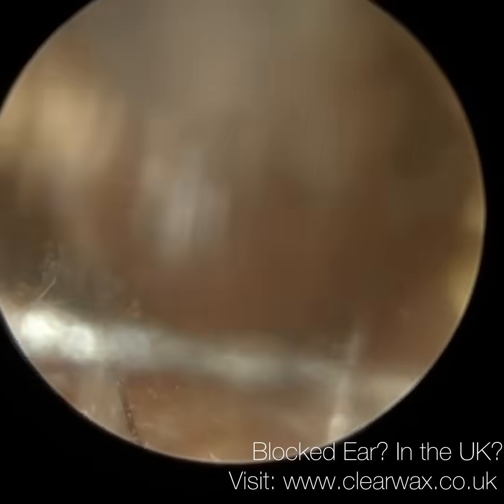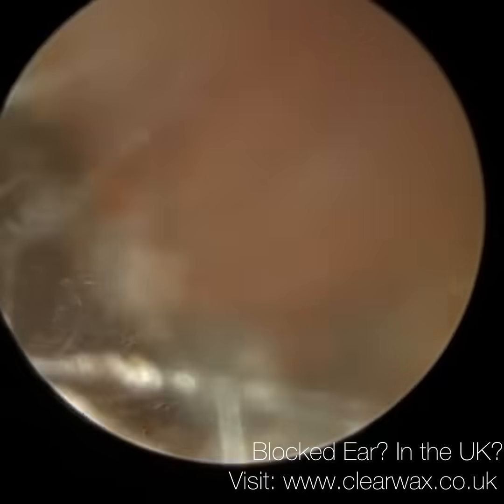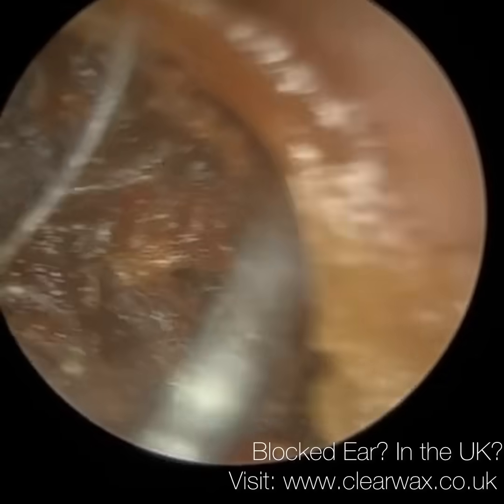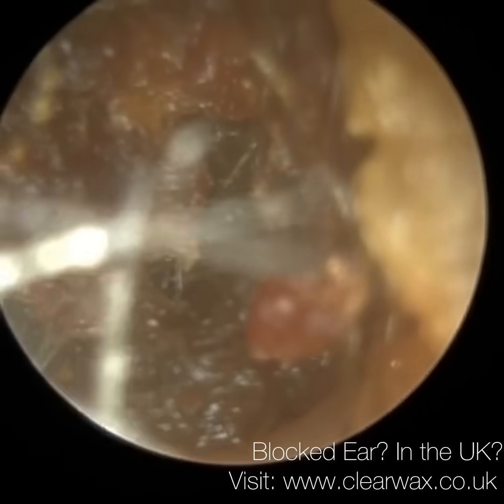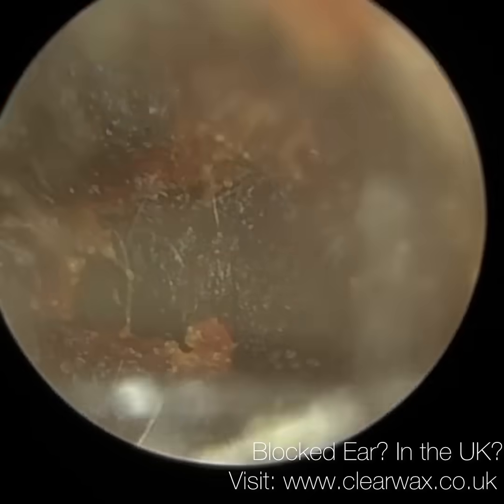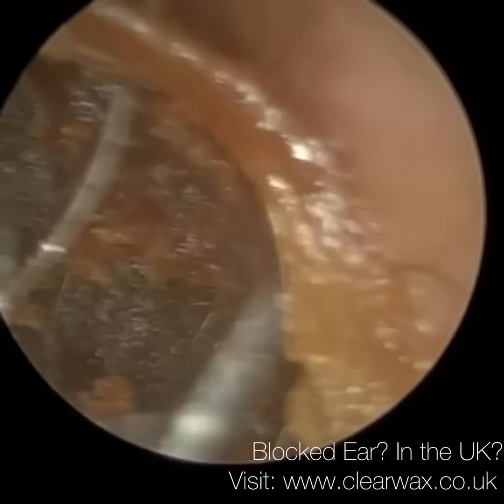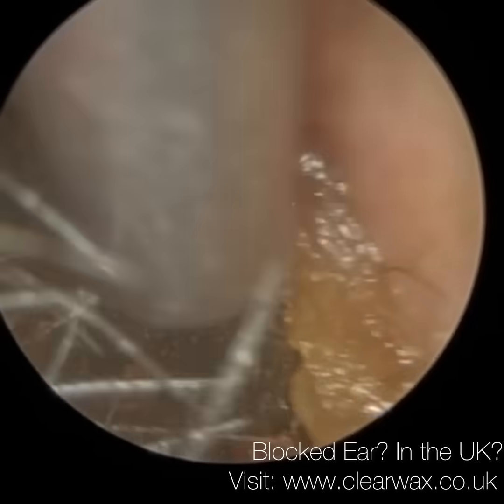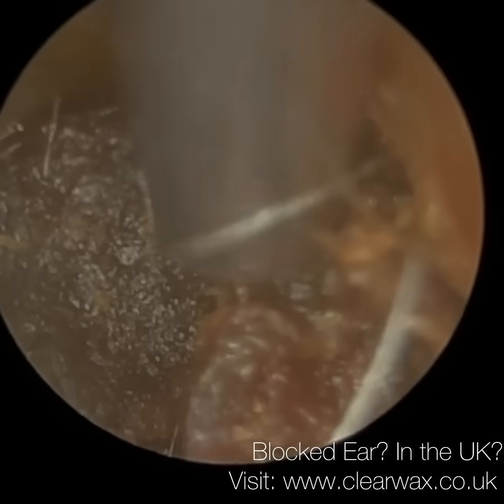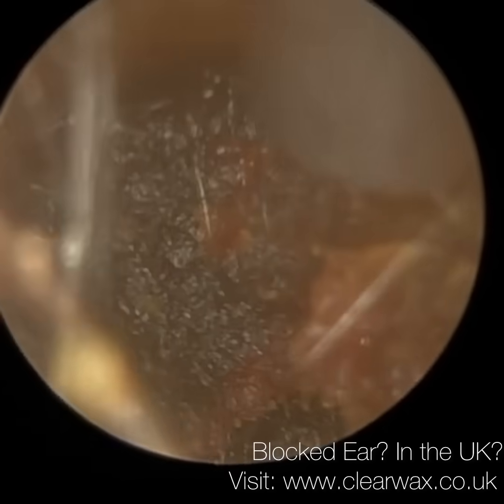I'm putting it adjacent, parallel to the first bend, and then pushing the left-hand side of the endoscope to the left, pushing the cartilage to the left, which then opens up the ear. So if you've got loads of hairs in that region, naturally you're going to see some of them. And also if the wax is right up against the first bend, when you're using the endoscope to dilate open the ear canal, you're going to get a really zoomed in view of the wax.